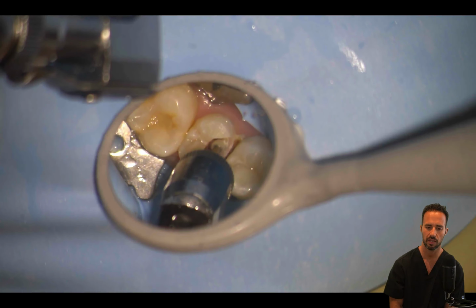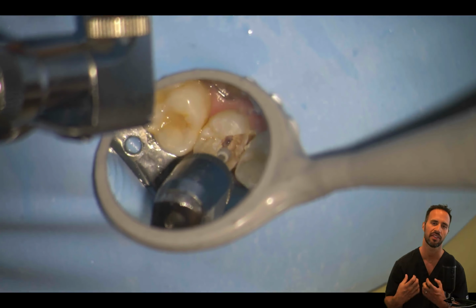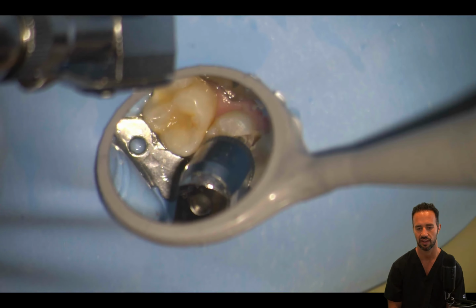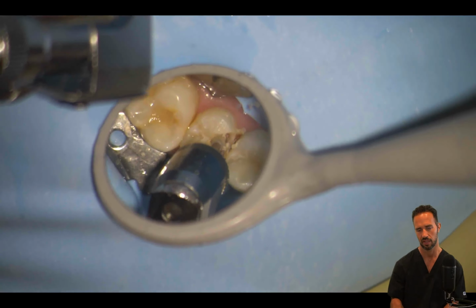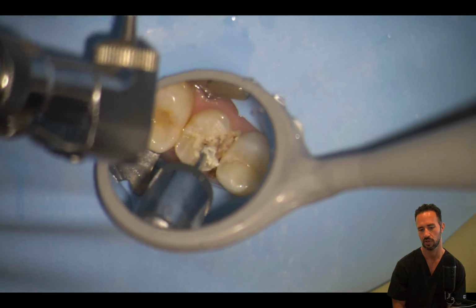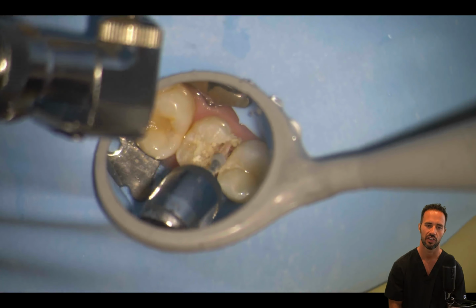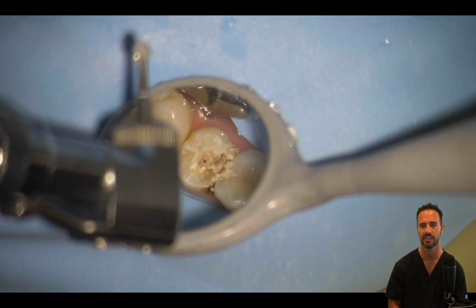And I'm just taking my time here, making sure that all the caries is removed before I get into the meat and potatoes of the endodontic procedure. So take your time. Sometimes this is one of the more time-consuming aspects, just to make sure you're on sound, solid tooth structure, and that you're not leaving any caries behind.